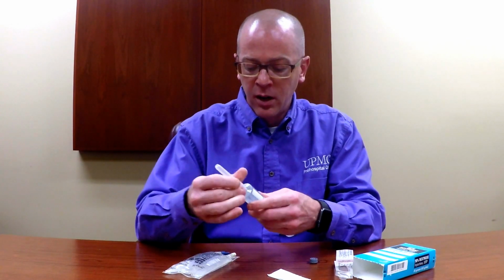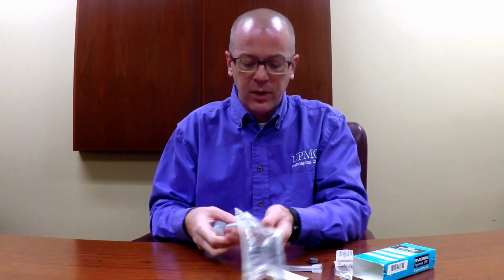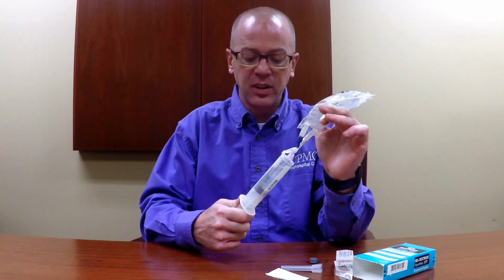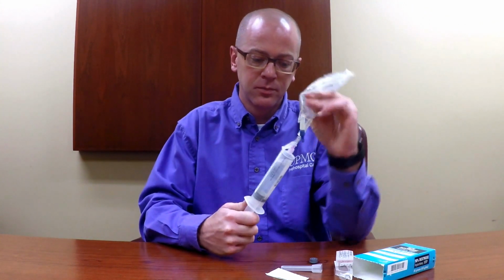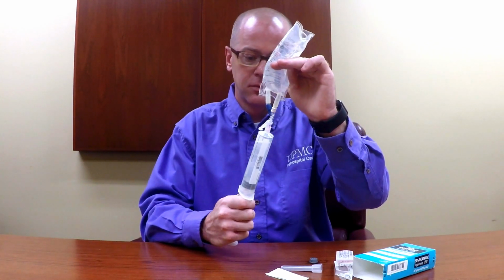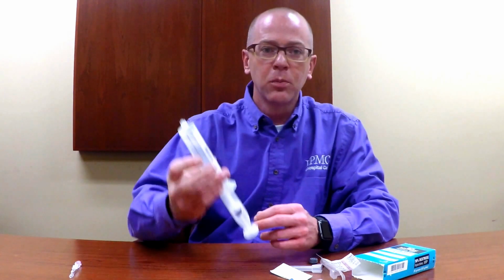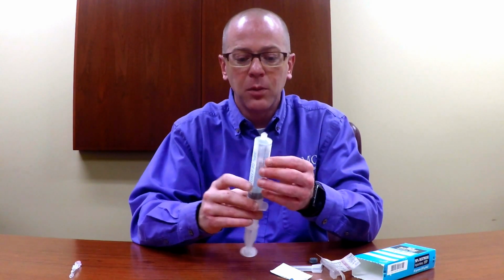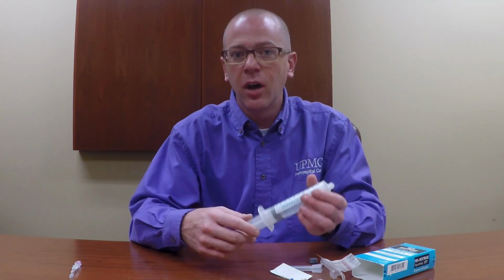So I'm going to connect a needle. I'm going to use a 100 bag of normal saline because it's what I had available, and I would clean the port off, and I can refill this syringe back to the initial 50 cc volume. Dispose of my sharps. So I mix this around. Now I've turned my pre-filled into a D25 solution with 12.5 grams of dextrose and 50 cc's of total volume, and I would administer that 2 cc's per kilo to this child.